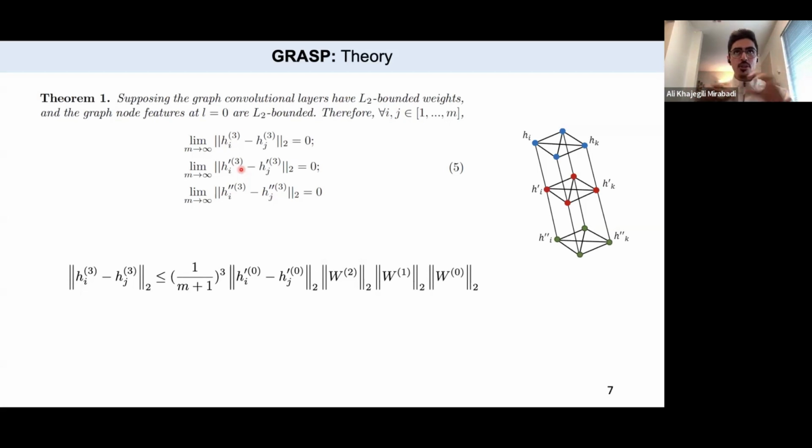So for the publication, we just put the 20x, which is a standard. But we wanted to make sure that the architecture has an improvement. We did different experiments, and we looked at 5x, 10x, and 20x separately and a combination of them all. And they usually do better on 20x. And I think their original architecture is 20x too.